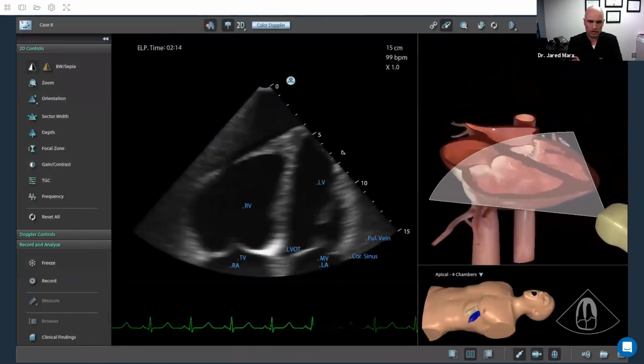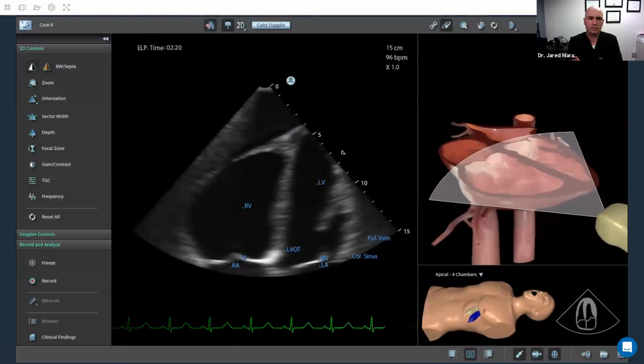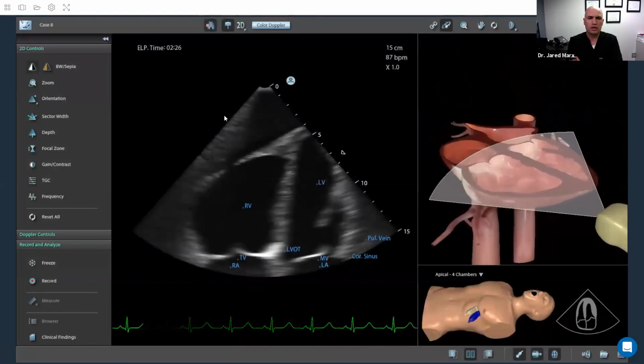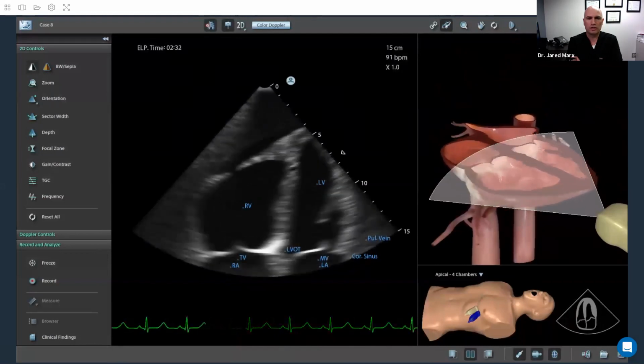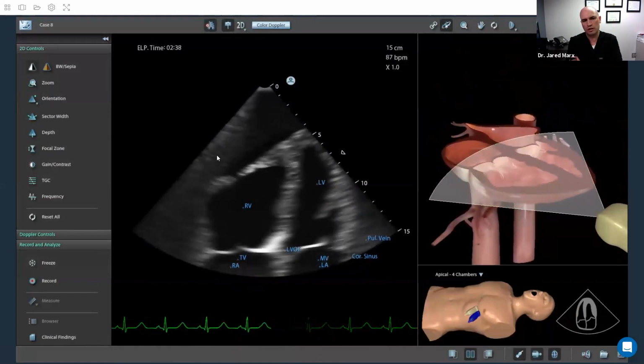Fortunately, it still has pretty good function, but this is typically something I don't see. It more develops in the ICU, but I have had patients present with significant right-sided heart failure due to the amount of fluid in their lungs, and from my experience so far, that is not a very good sign for the patient. But this can give you an example of what different findings look like when seeing that disproportion of the right ventricle to left ventricle for the patients you'll be taking care of.